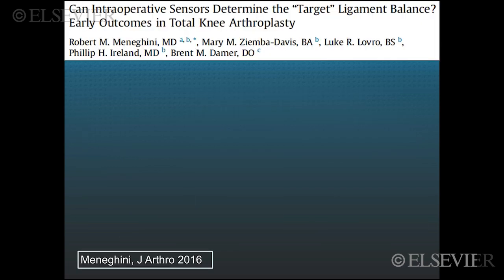You know, mechanical alignment total knee arthroplasty, we're indebted to Meneghini and his group, 3 surgeons. 2 did mechanical alignment with navigation and 1 did gap balancing. They're the only study that I can find in the literature that publishes their forces. Everybody else publishes ratios, medial force to lateral. It's useless data because you could have 14 pounds medial, 7 lateral, a difference of 2. So double force in the medial than lateral, but it could also be 1400 versus 700, a difference of 2. So reporting data as ratios, those studies really should just be disregarded.